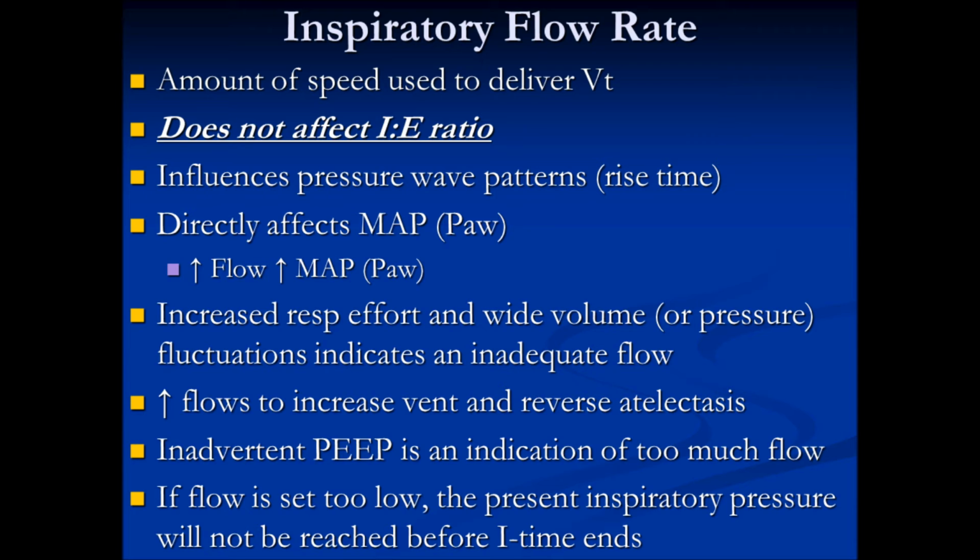It's going to take a longer time to rise to the pressure. It directly affects your MAP, which is also your Paw, which is mean airway pressure. So as you increase the flow, you increase your mean airway pressure or your Paw.